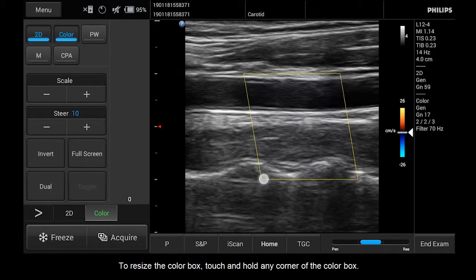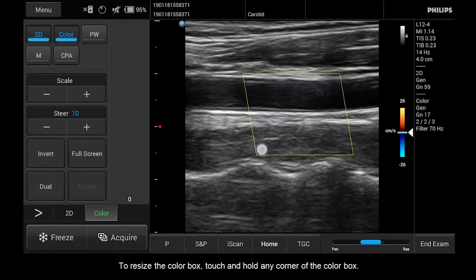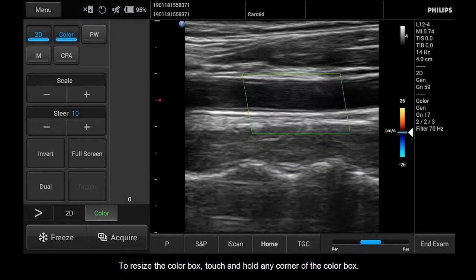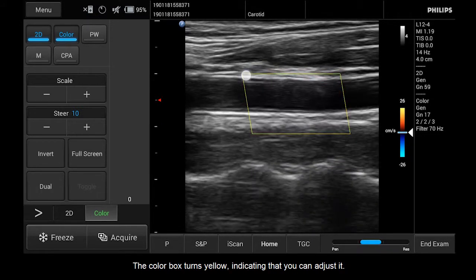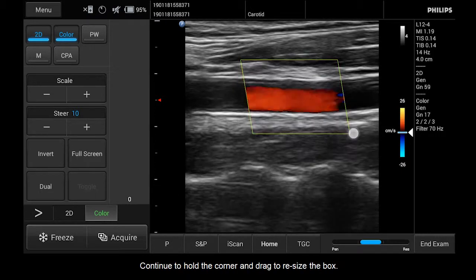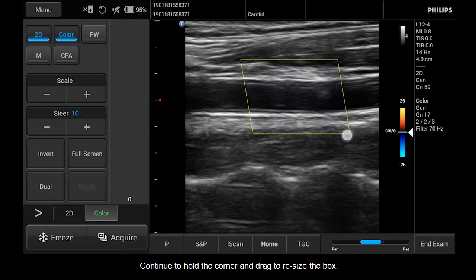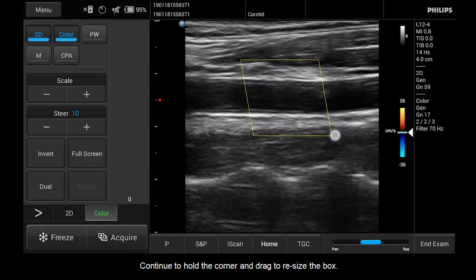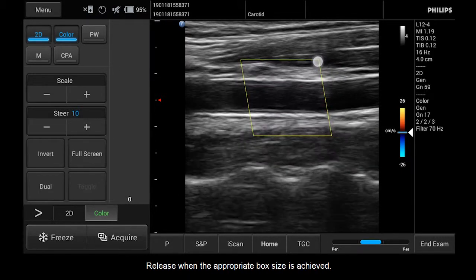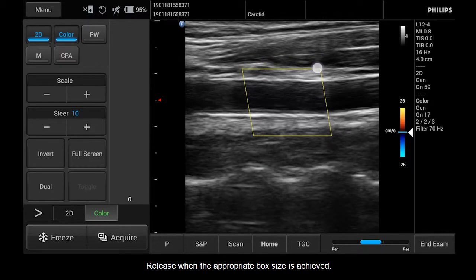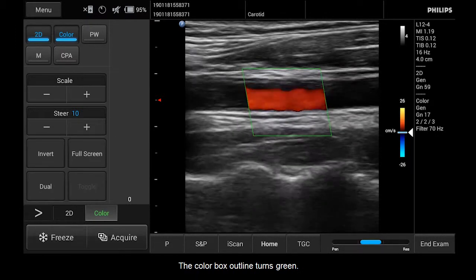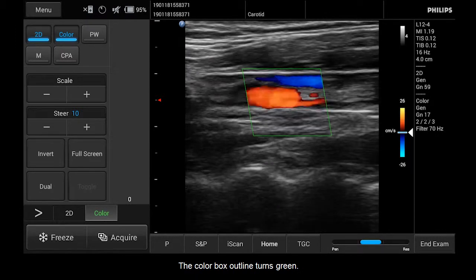To resize the color box, touch and hold any corner of the color box. The color box turns yellow, indicating that you can adjust it. Continue to hold the corner and drag to resize the box. Release when the appropriate box size is achieved. The color box outline turns green.